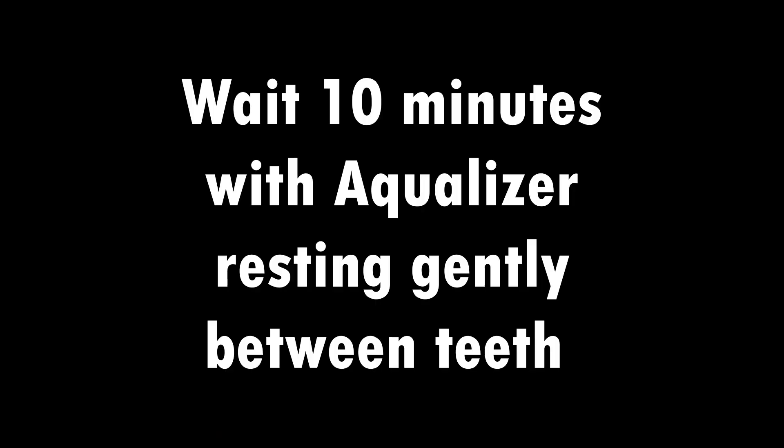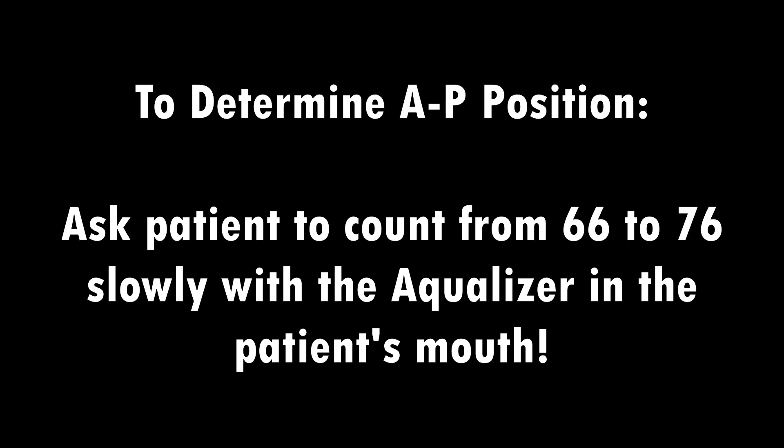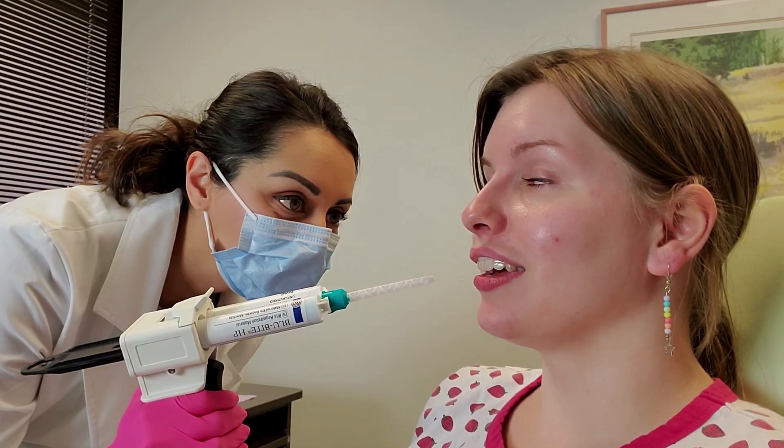The Aqualizer website says it takes five minutes, but I do ten minutes usually to get the muscles nice and deprogrammed so they float to their happy place. Once the ten minutes are over, we will record the bite. As dental practitioners, we will decide the AP — the anterior-posterior position. The way we do this is to ask the patient to count from 66 to 76 slowly with the Aqualizer in their mouth. It may be kind of awkward for the patient to talk with an Aqualizer, but what you're looking for is determining where the jaw wants to be. Counting from 66 to 76 allows us to see where the jaw positions itself. It's helpful to have an assistant watching from the opposite side at a 30-degree angle to the patient as well — two sets of eyes are always better than one.